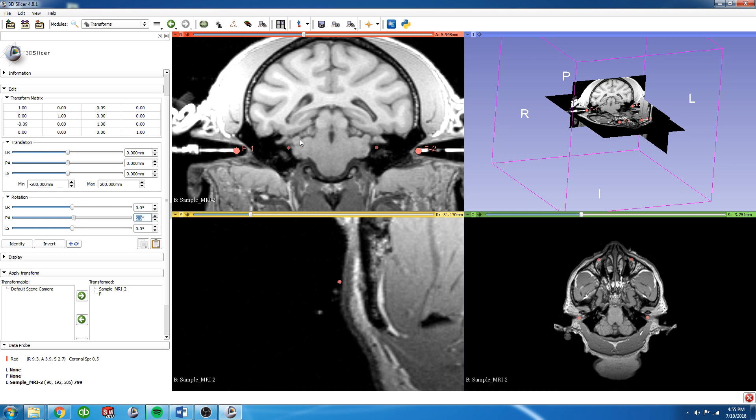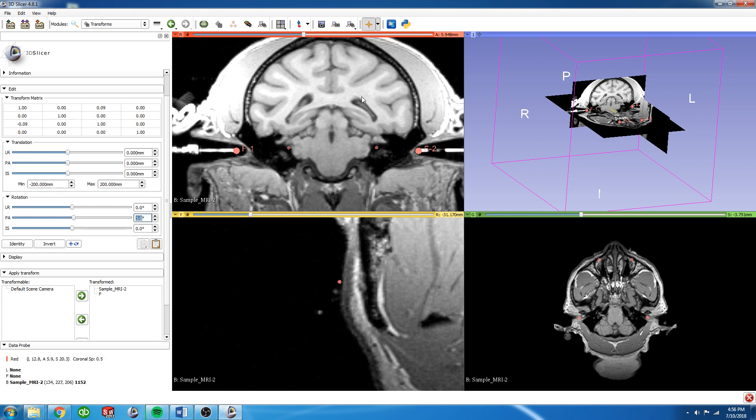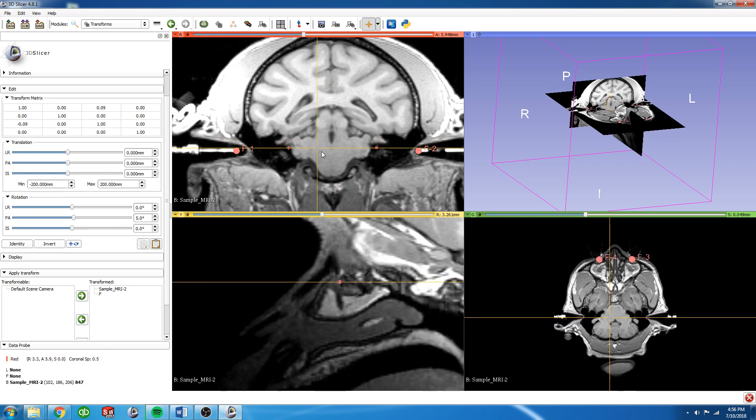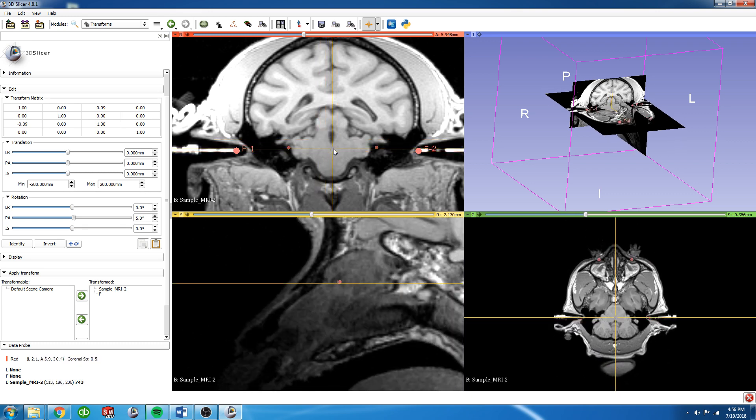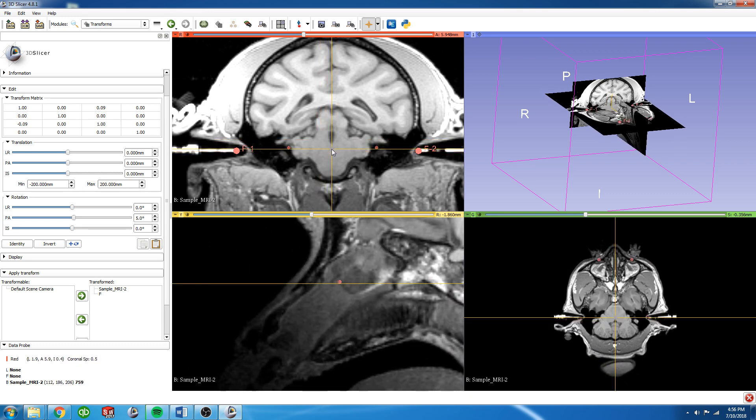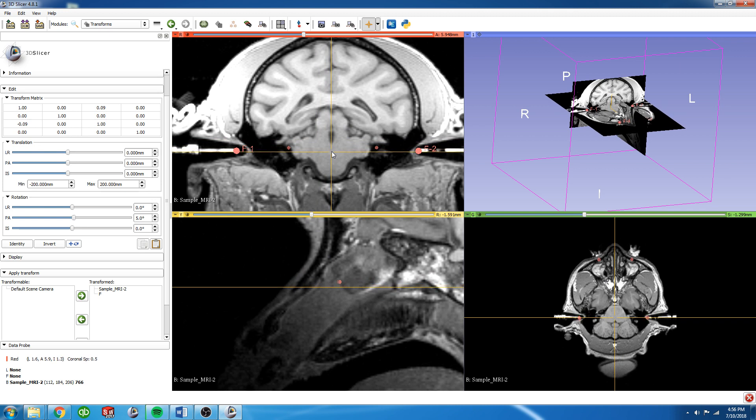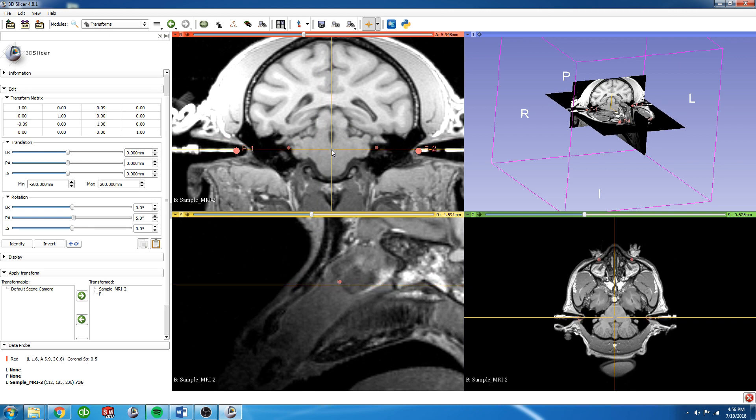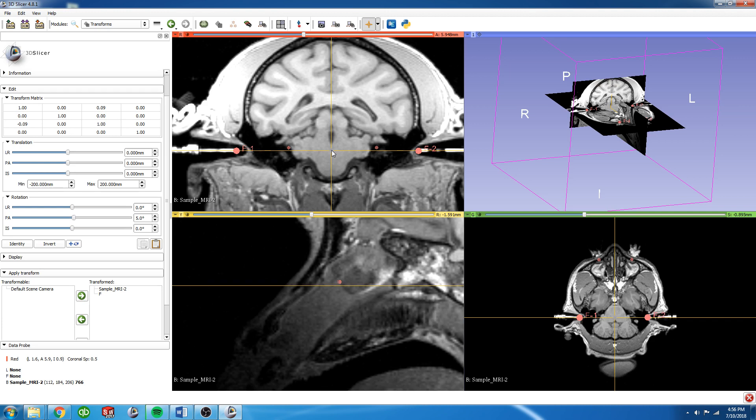From here you can use the crosshairs button up here. This will put crosshairs onto the screen which you can control by holding the shift key. So I'm going to place that so that it's cutting right between those two ear bar fiducials as best I can. Right there. Now when I let go of the shift key this will stay.